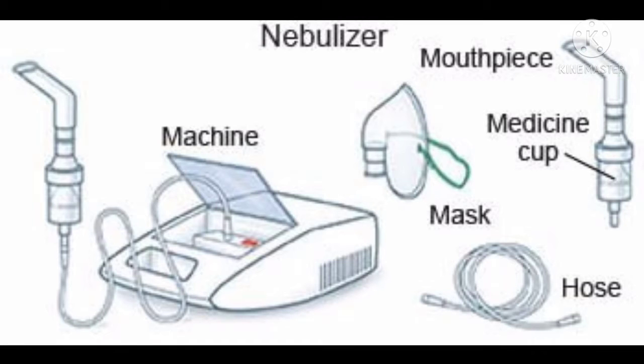For the equipment, we need a prescribed air supply, piped in cylinders or via a portable air compressor, adapter, nebulizer apparatus or machine, mouthpiece or appropriate oxygen mask, prescribed medication, and the sputum cup.